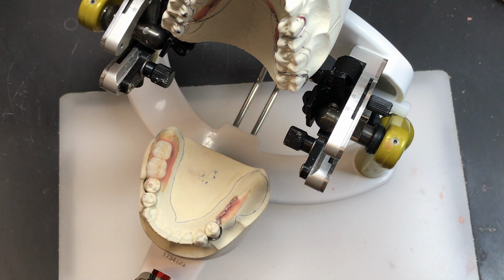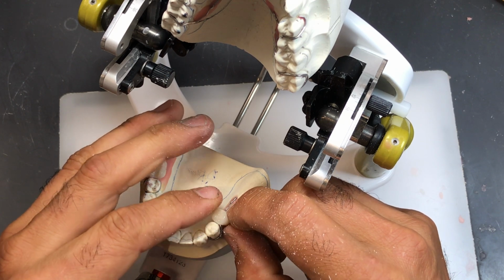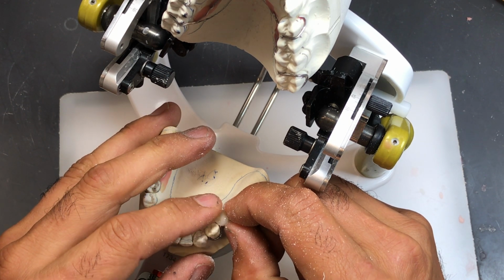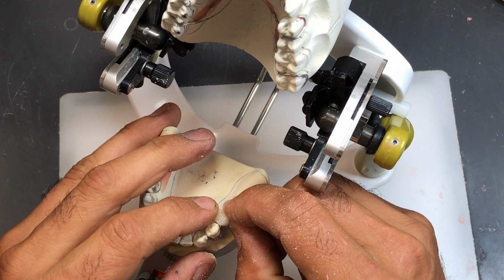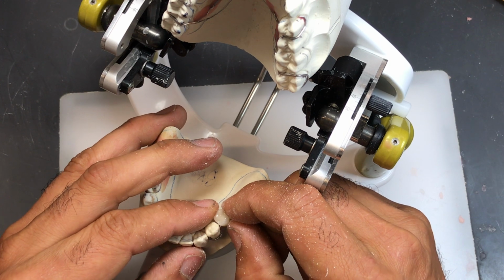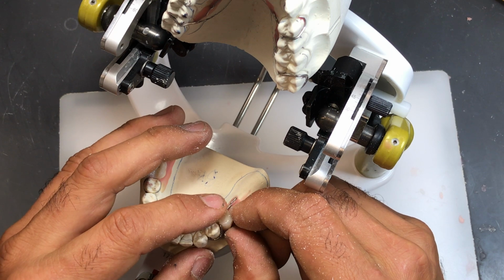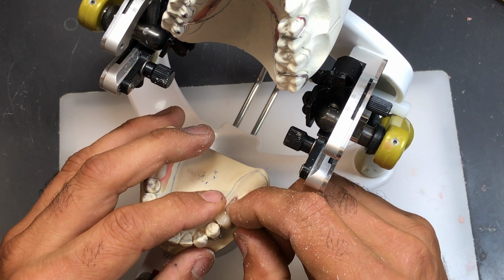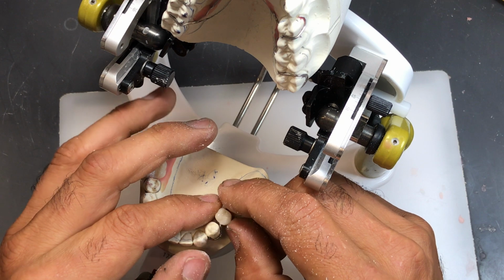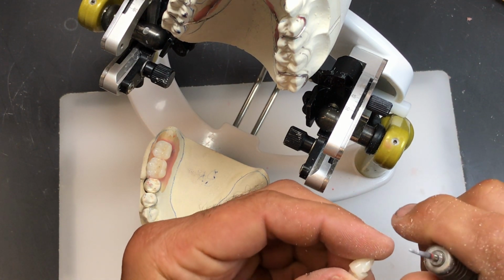So take your time with this. You don't want to over grind around the wire because you're going to create a big space that's going to get filled in with pink acrylic, and that's not good. That's pretty good. I think I'm touching, and it looks like I'm at the right height. You probably can't see it on camera. I think I need to reduce a little bit more. Need to reduce a little bit more in here.